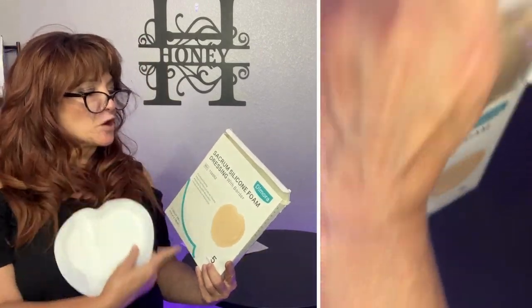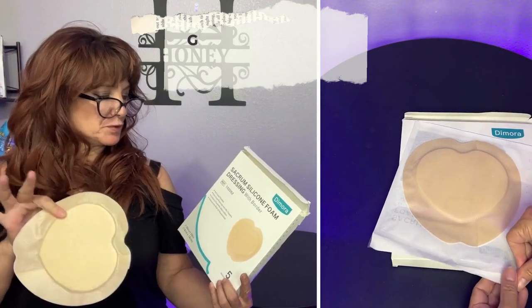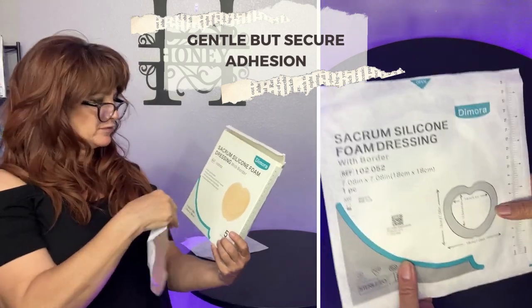These are sacrum silicone foam dressings with a border by Dimora. They're soft, they're flexible, they're pain-free. They're pretty easy to remove — the sticky part isn't super painful when you remove it.